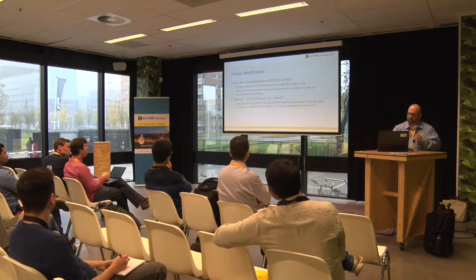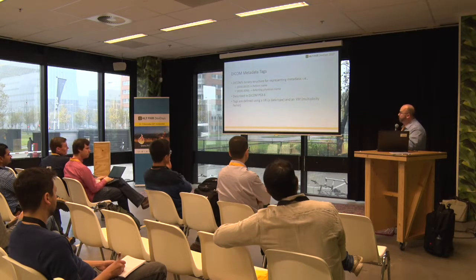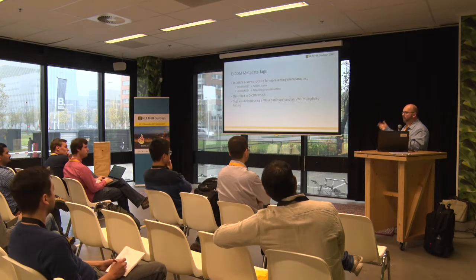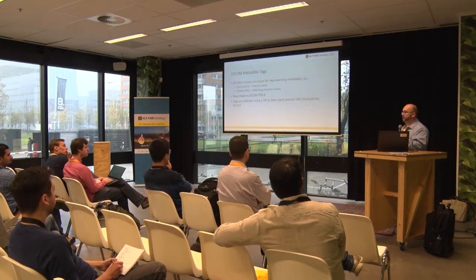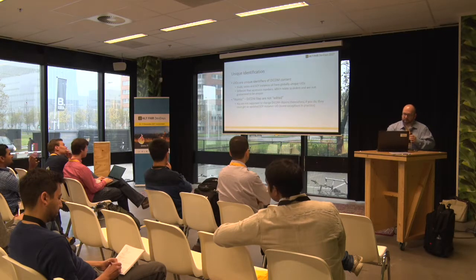Quick question. Yeah, absolutely. On those tags, I see they're divided up into two segments. Does each segment have a meaning separate from the other? Yes, absolutely. So the first four digits are the grouping. For example, the 0010 grouping is all data about the patient. So 0010 followed by something like 0040 or 0030 might be the gender, the date of birth, and you can find all the patient data under that 0010 grouping. Cool. And 0008 is about the study, the order information, and there's different groups as well. And then vendors could also define their own private tags, which are separate groups out of this. Thanks.